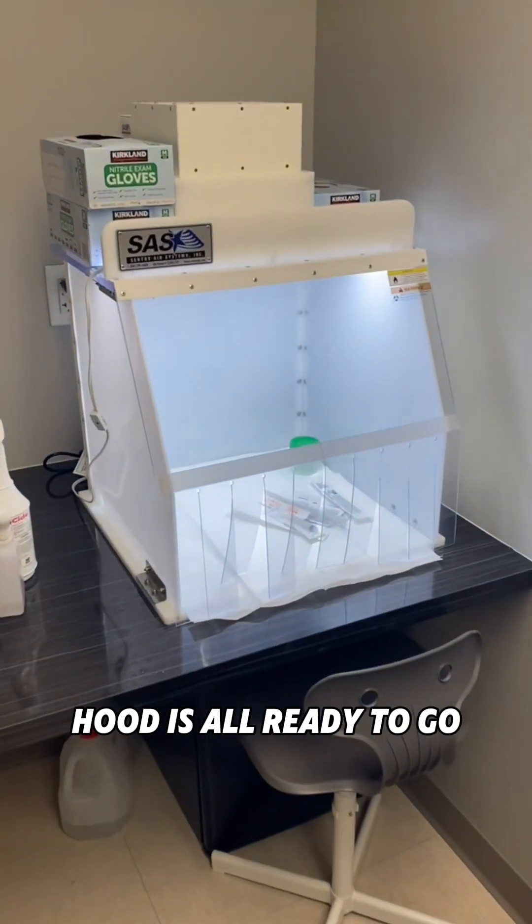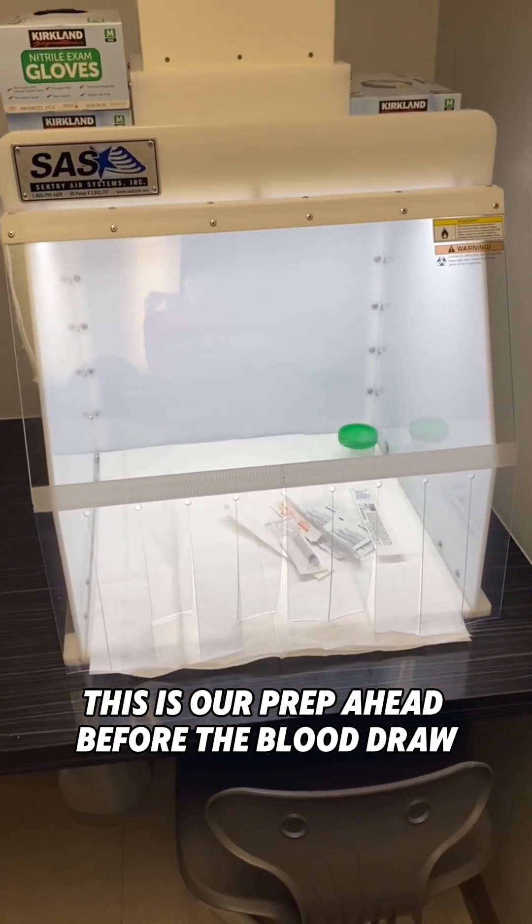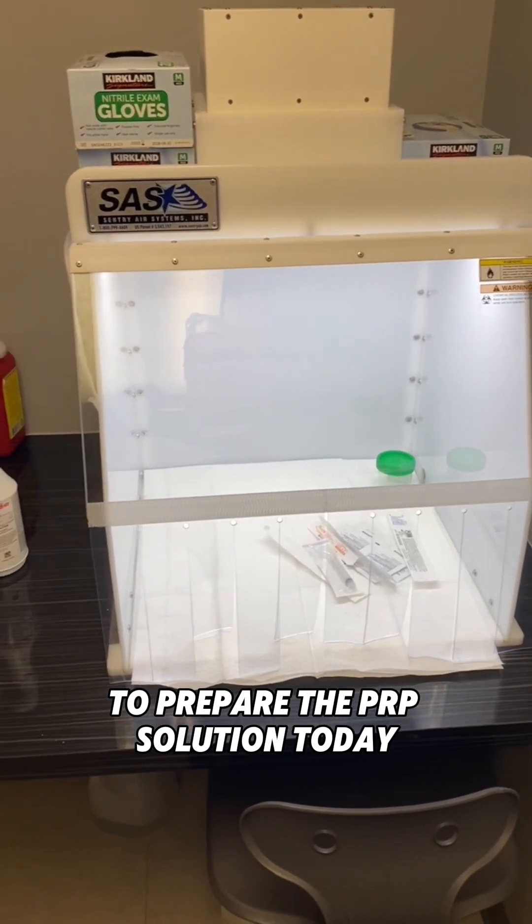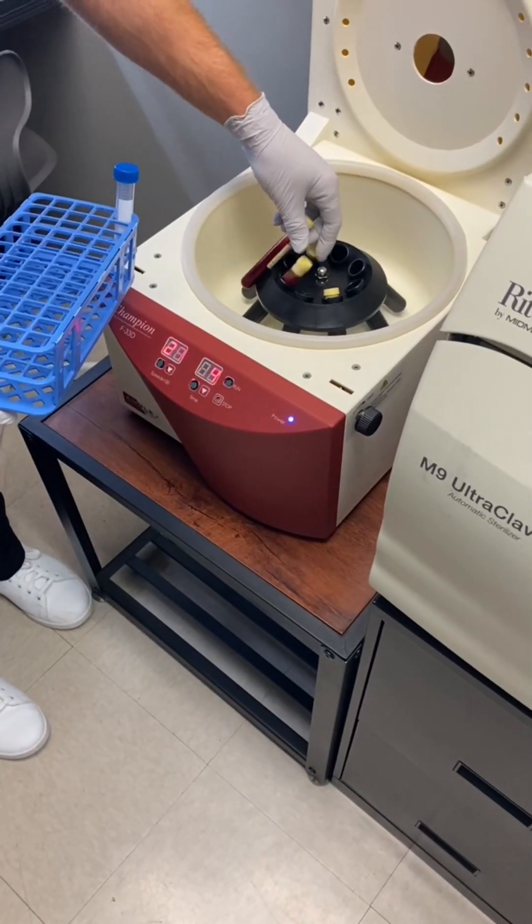The hood is all ready to go. This is our pre-prep ahead of the blood draw to prepare the PRP solution today.